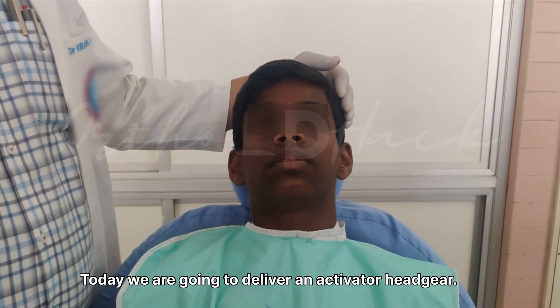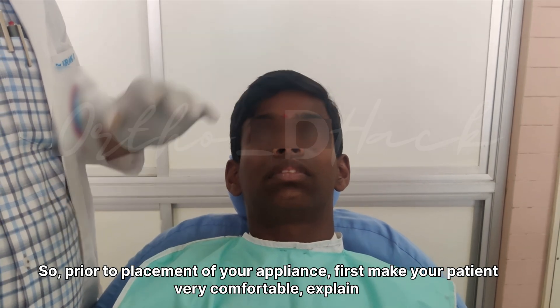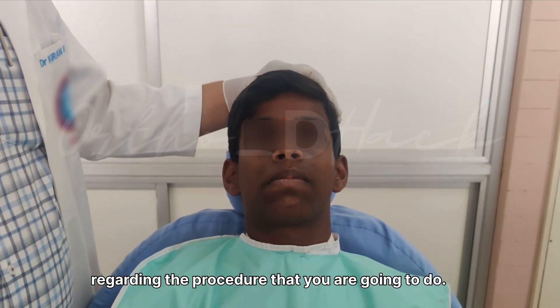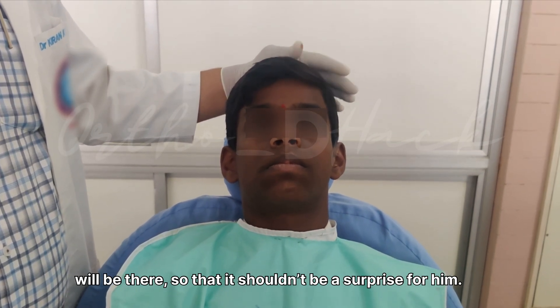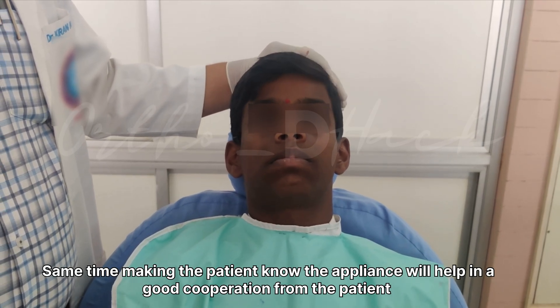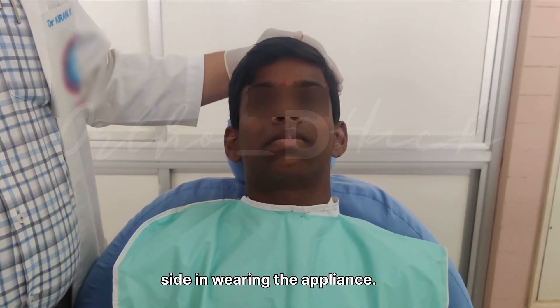This is a patient and today we are going to deliver an activator headgear. Prior to placement of your appliance, first make your patient very comfortable. Explain regarding the procedure that you are going to do. He has already been briefed and shown photographs of how the appliance will look, so he should not be surprised. Making the patient aware of the appliance will help in good cooperation in wearing it.